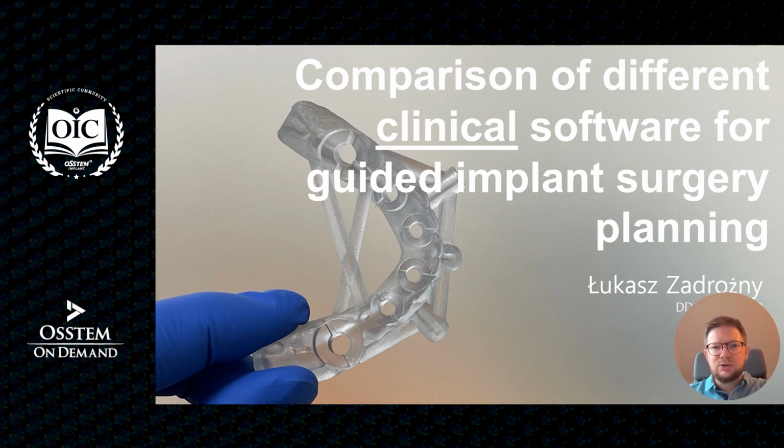Today I would like to share with you some insights from the topic I'm dealing with for some time, mainly comparison of different clinical software for guided implant surgery planning.